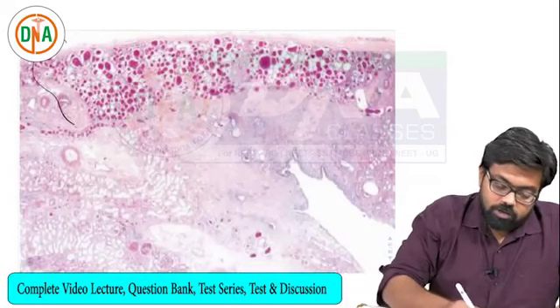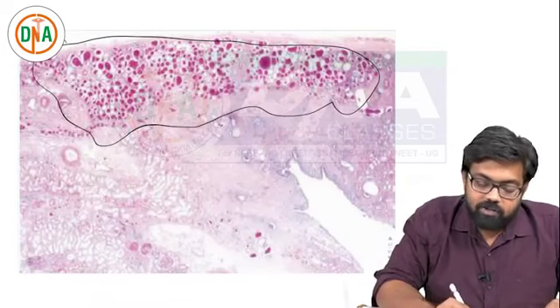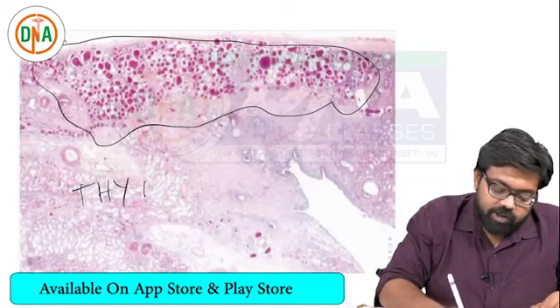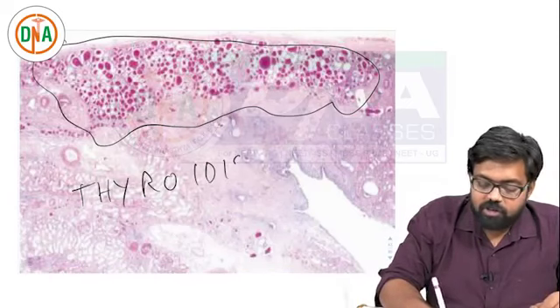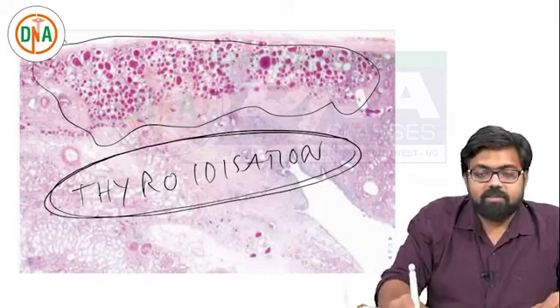So you come across multiple atrophied tubules filled with secretions, resembling thyroid tissue. So this is called thyroidization. Thyroidization is specific to chronic pyelonephritis. Many times an image-oriented question is asked.